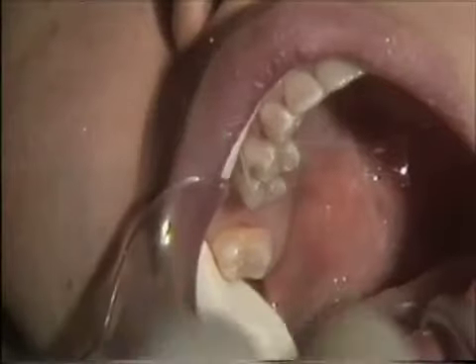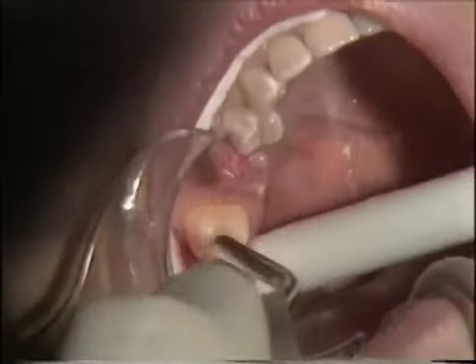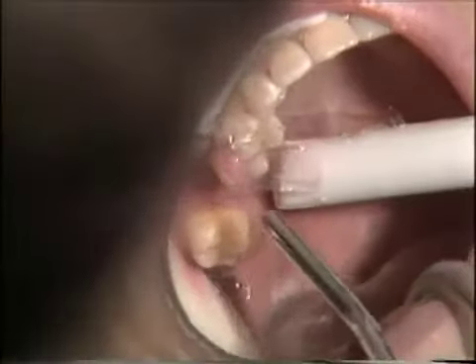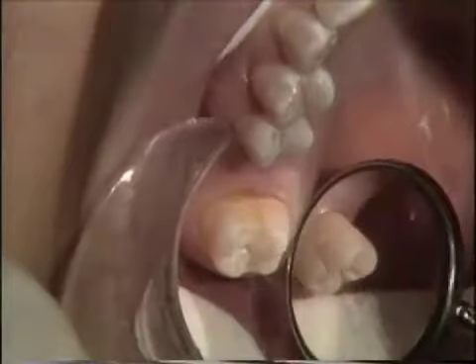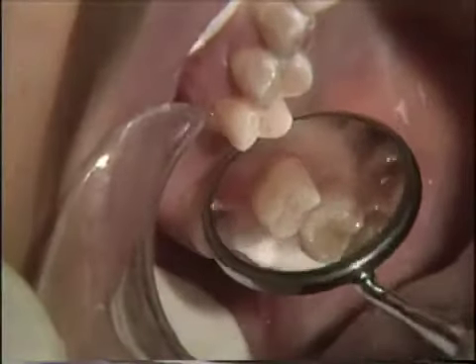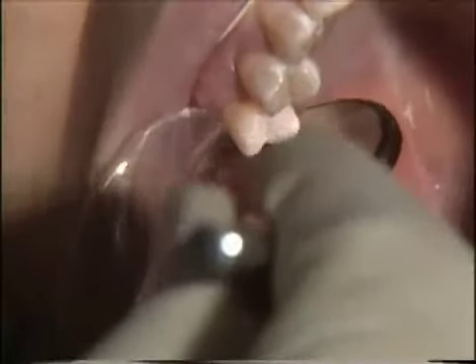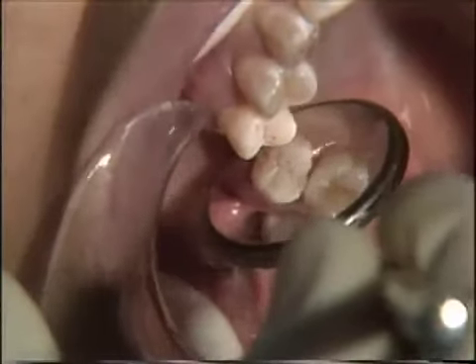Now we are going to etch using an etchant gel and place that on the lingual surfaces. You'll notice that we have a good solid frosting on the distal of the bicuspid and the occlusal rest.